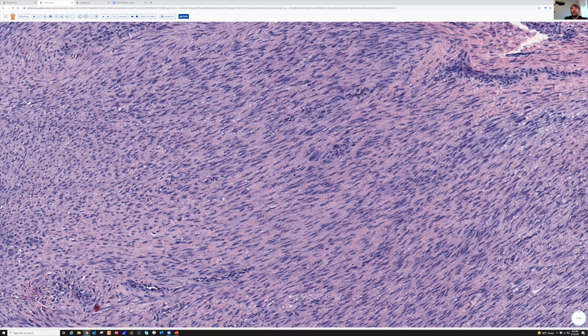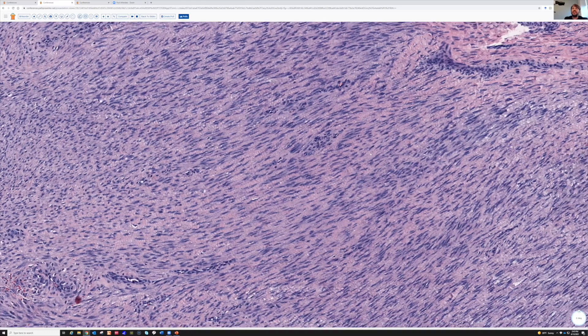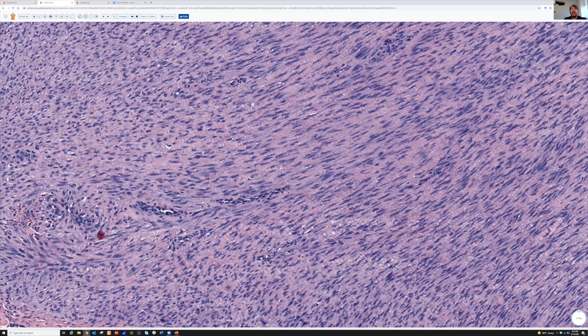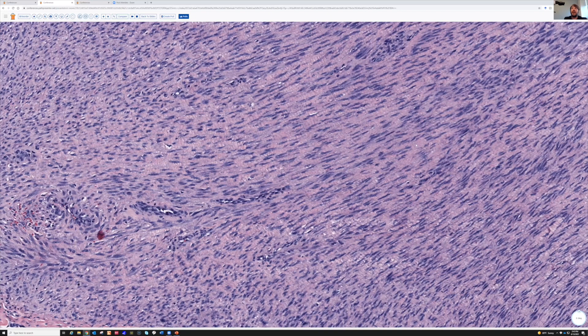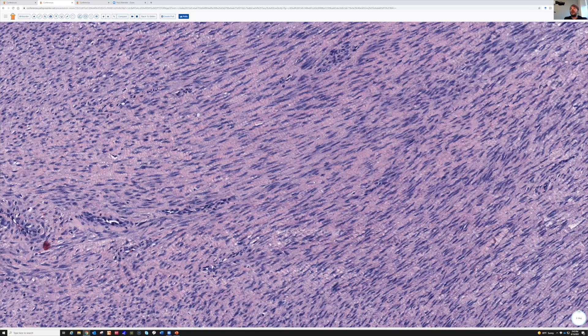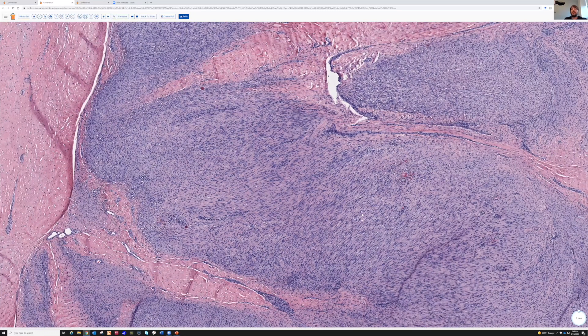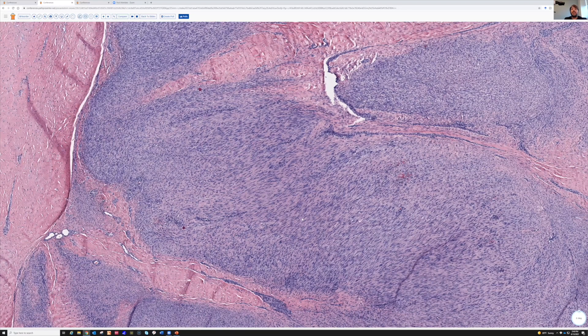The reason I wanted to show this case is because this is a pretty big and cellular example of fibromatosis. There are some mitoses — here's one right here. The cellularity, the mitotic activity, and the size of the lesion might make you concerned that this is something bad. You might even think this is like a synovial sarcoma.